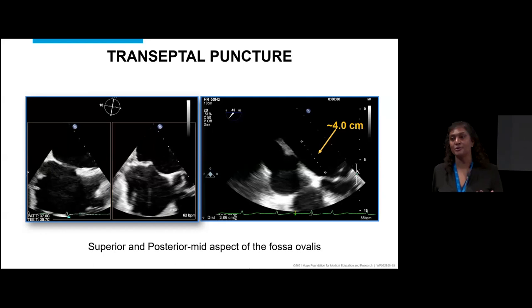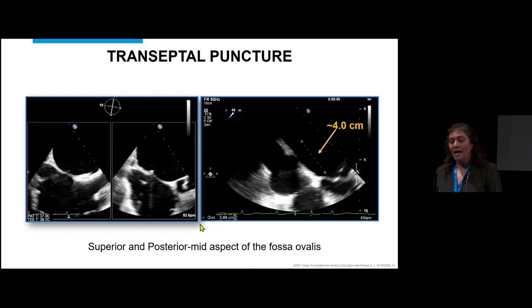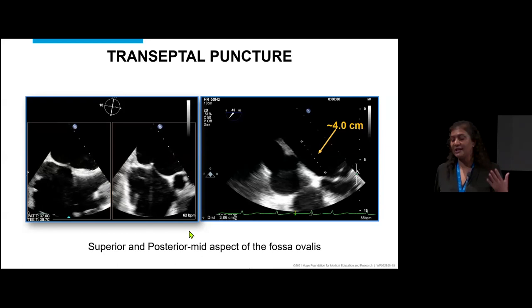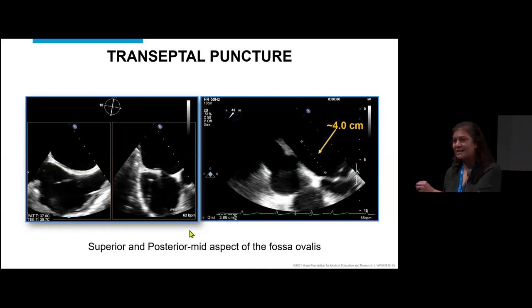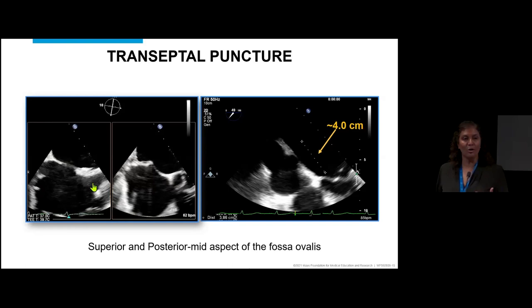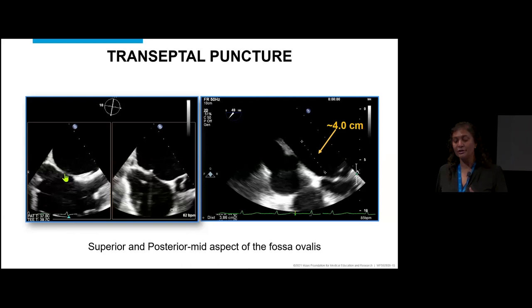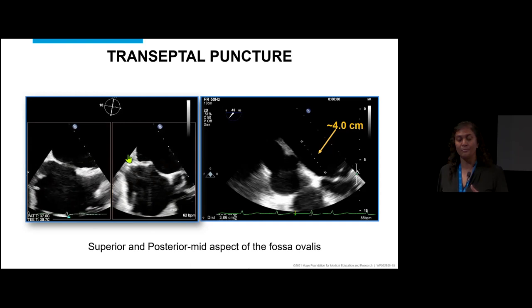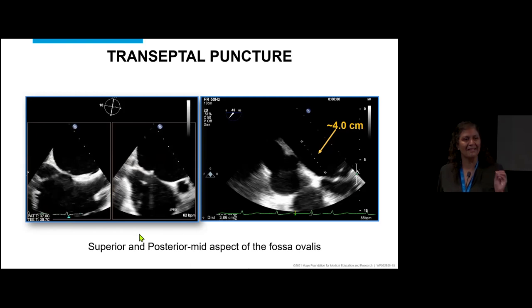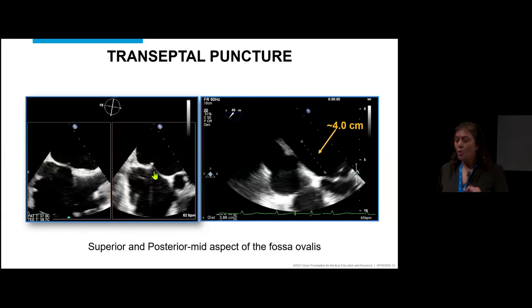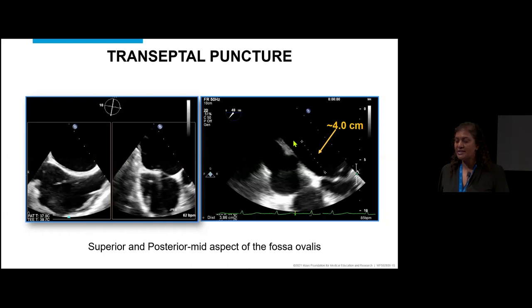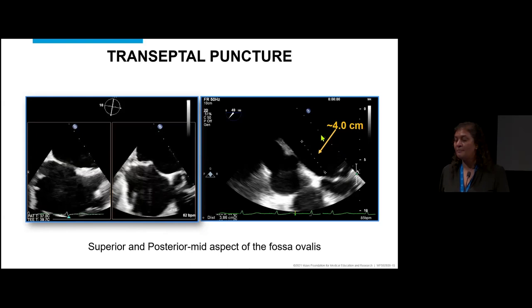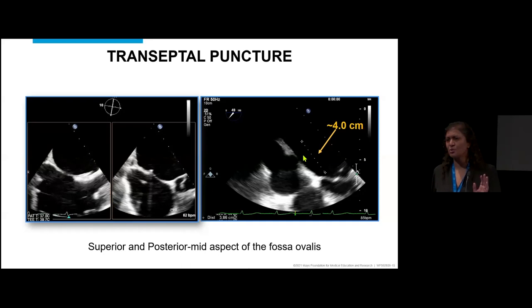Our patient is going to go for MitraClip. The procedural process begins with transeptal puncture, which we assess from a superior-inferior view at the bicaval view — with SVC here — and an X-plane giving anterior-posterior. The goal for transeptal puncture is superior and posterior, right at the fossa ovalis. When the interventionalist tents the septum, we freeze that, draw a line down to the mitral annulus when the valve is open, and measure that distance — we want it around 4 centimeters to ensure adequate steerability for the clip.